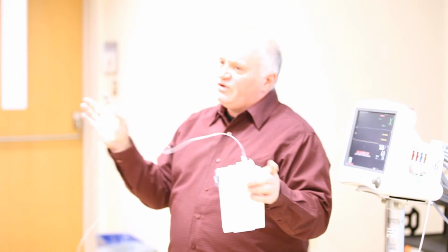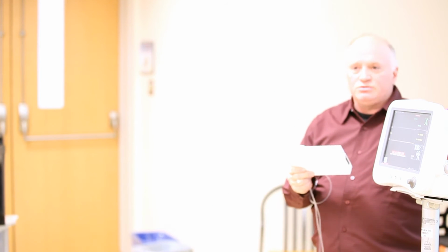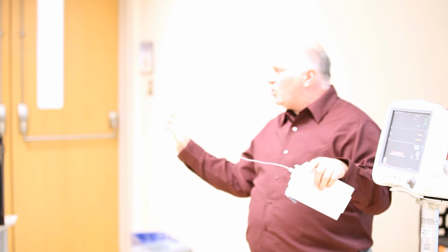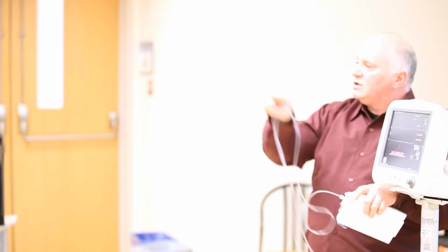As discussed, there's two variables with end-tidal CO2. One is cardiac output, one is alveolar minute volume, right? So if all things are the same, and with the changing waveforms that Brendan had actually shown, if we have an unstable cardiac patient post-arrest and their waveforms are decent and then they start to drop, if they're on a ventilator and we're controlling the ventilation, if the waveforms are dropping, that means their cardiac output is dropping. Does that make sense?